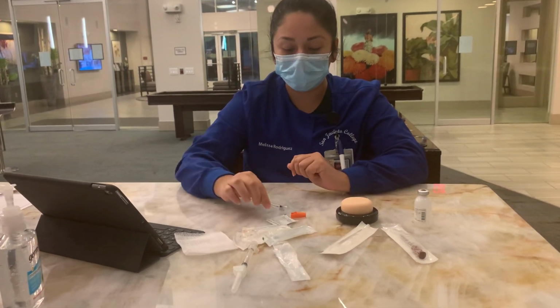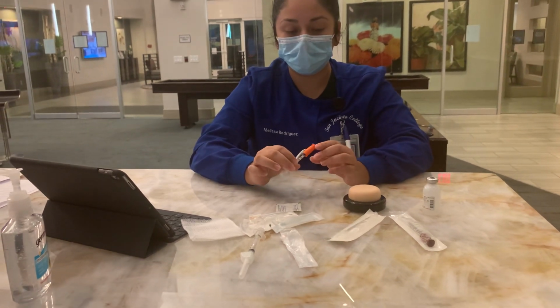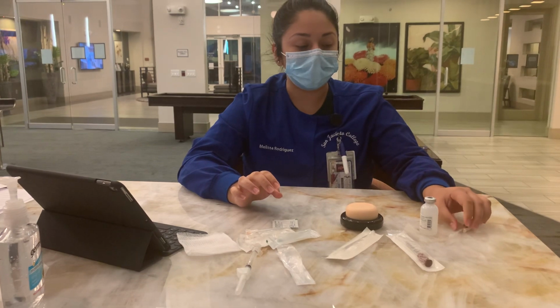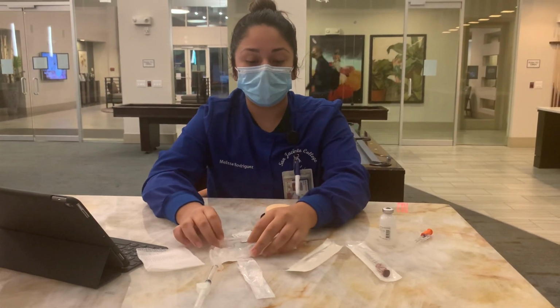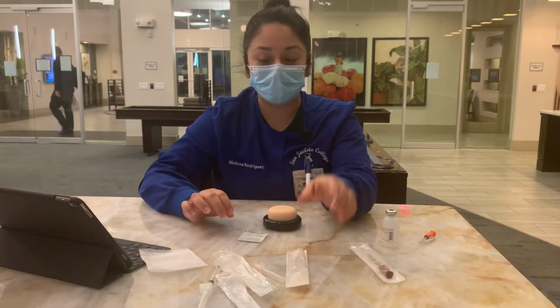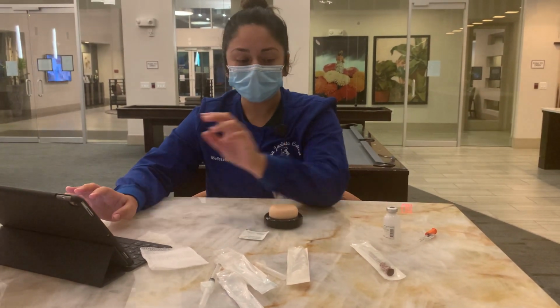I'm gonna recap my needle and dispose of it in the sharps container. Same thing for subq, assess after 30 minutes for any type of reaction. Now, before I go to my next one, I'm also gonna document the injection was given.